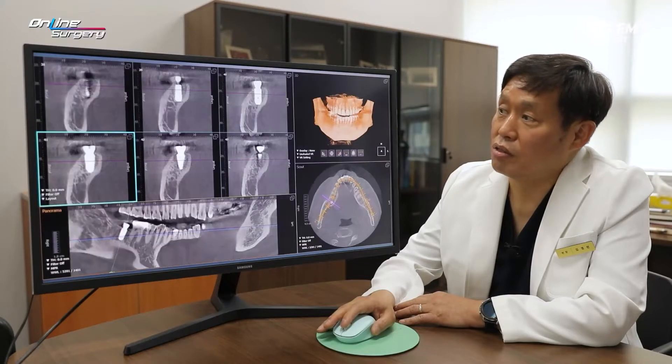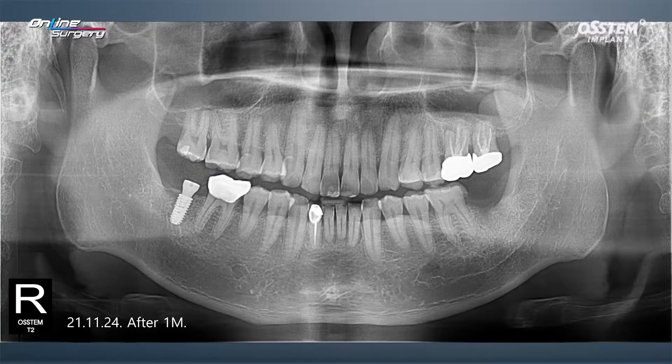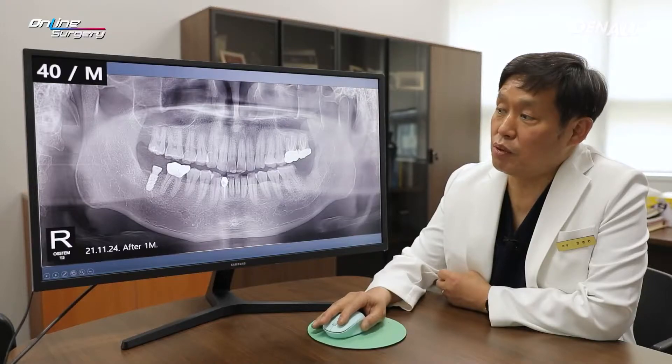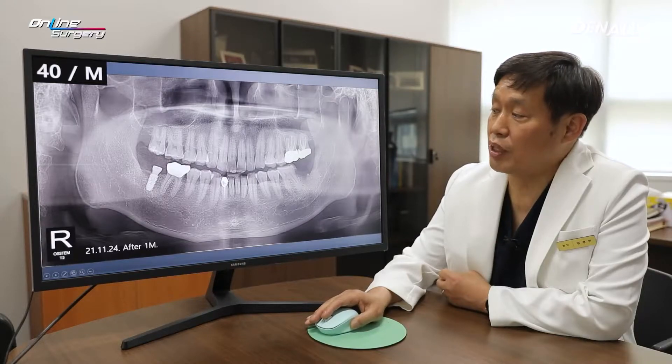On the post-op CT image, as planned, the implant has been well positioned and the healing abutment is connected. In number 47, a month has passed since surgery — it's been approximately three months since extraction. A VA surface implant was placed and we're waiting for prosthesis delivery.